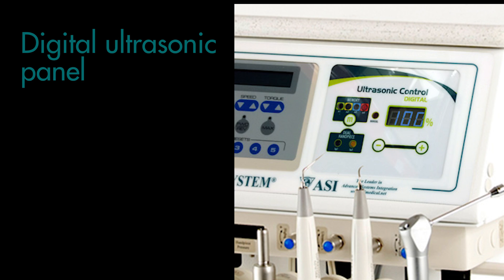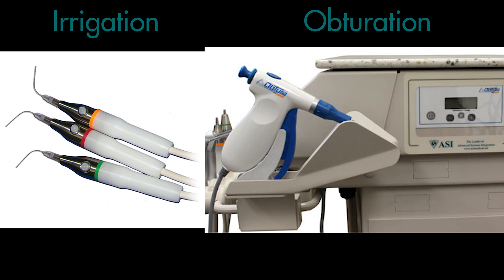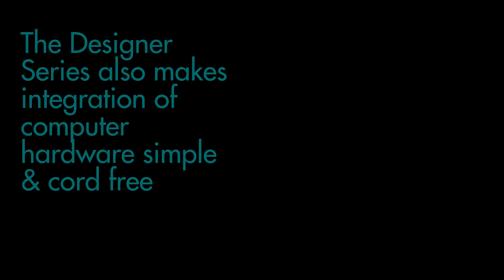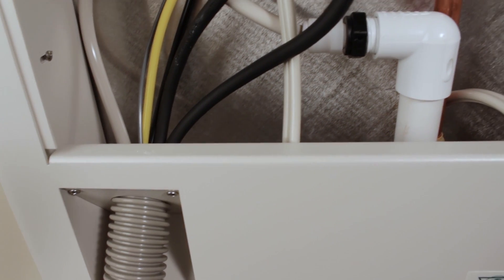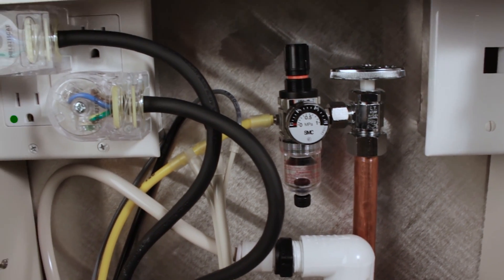ASI's digital ultrasonic panel allows the use of either a single or dual piezo-ultrasonic handpiece. Endodontic irrigation and obturation are also popular features that can be added. The Designer Series also makes integration of computer hardware simple and cord-free by allowing monitors, USB connections, and cables to be run through one common umbilical to an ASI in-wall junction box or floor box.